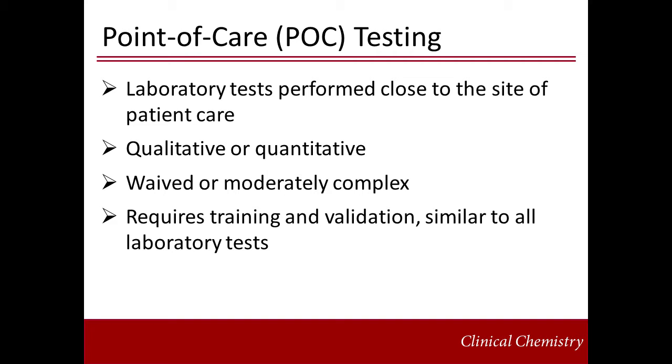Depending on the testing, the College of American Pathologists, or the CAP, will deem these tests either waived or moderately complex. Waived tests will not require laboratory personnel to perform the test, and regulatory guidelines are minimal because the risk posed to the patient by an erroneous result is considered minimal. Other point-of-care tests are labeled as moderately complex and will therefore require more training, competency, and quality measures.